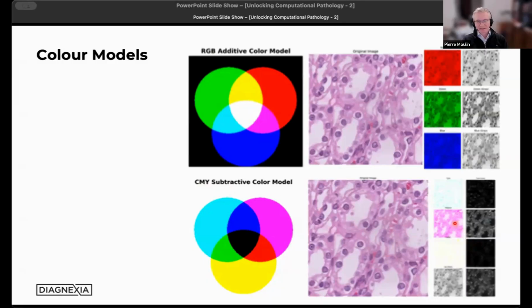It has a very different representation than the RGB, although they are theoretically complementary. But you can see that some of the pictures on the side here, although they are small, are very saturated. This gives you also a sense of how tricky it can be to adjust the image parameters for a reliable representation on paper. And that's why when you're loading your printer, you have to load 4 cartridges and not only 3.